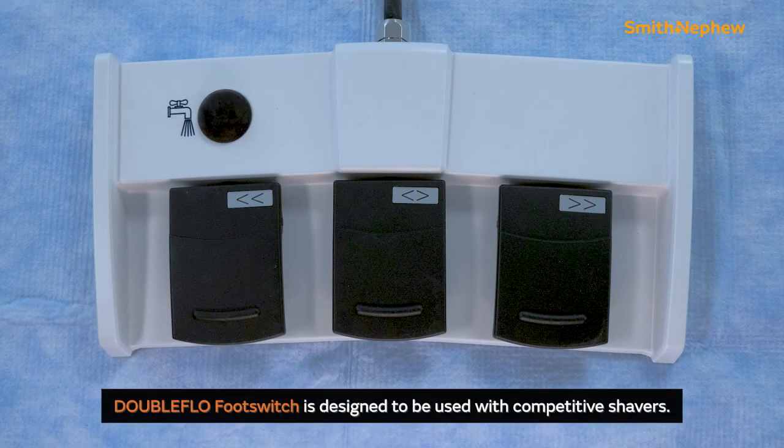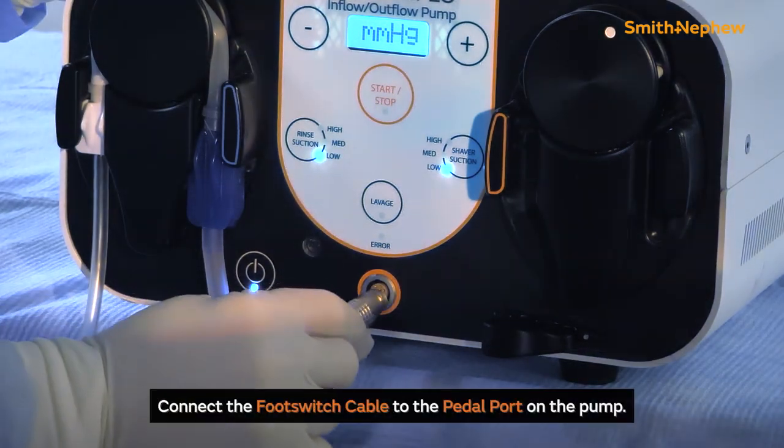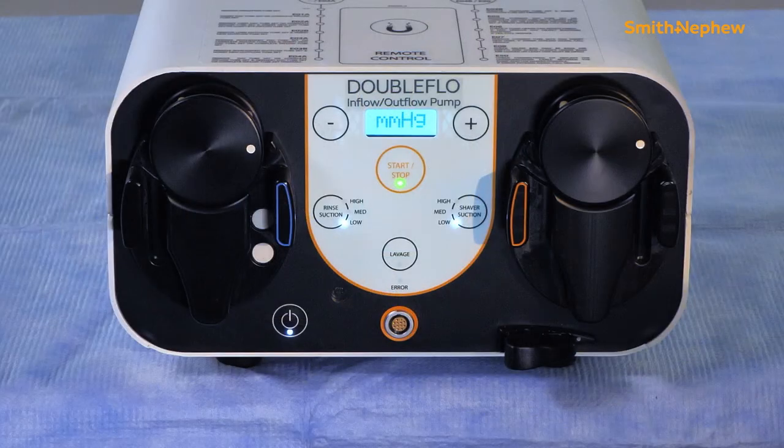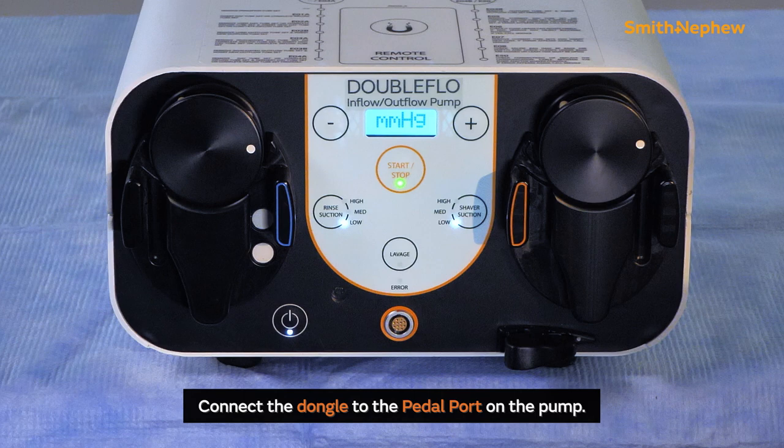DoubleFlow's footswitch is designed to be used with competitive shavers. Where there is a Dionix 2 shaver, the D2 shaver footswitch would be used. Connect the footswitch cable to the pedal port on the front of the pump. To set up the wireless footswitch, connect the dongle to the pedal port on the front of the pump.